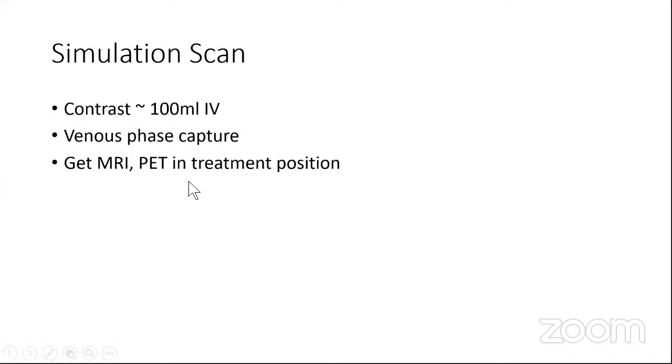And again, if you're going to add MRI and PET scans into this, most importantly, get an MRI only in the treatment position. Otherwise, if you get an MRI only in diagnostic scans and then try to fuse it, you will be able to fuse it in only one part of the entire series of scans or entire region of imaging. So to say, if you fuse on the GTV side, the part at the aortic bifurcation or the inferior part below the ischium may not match well. So these are the issues which we get.